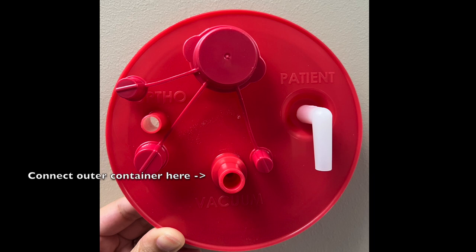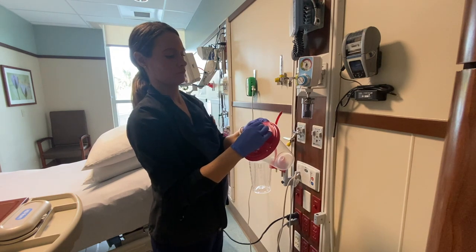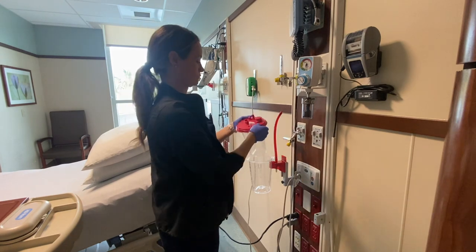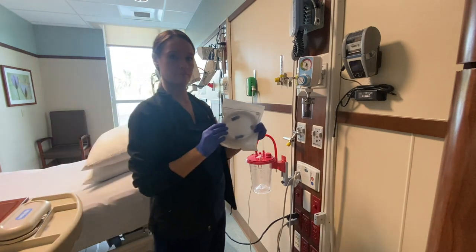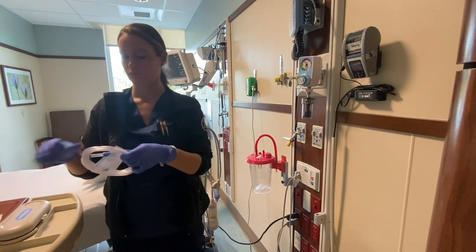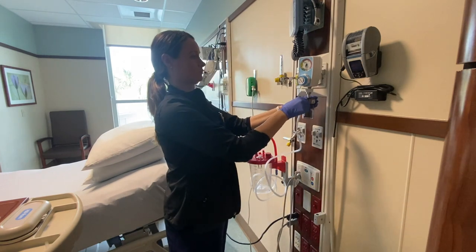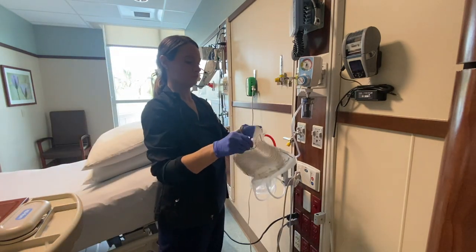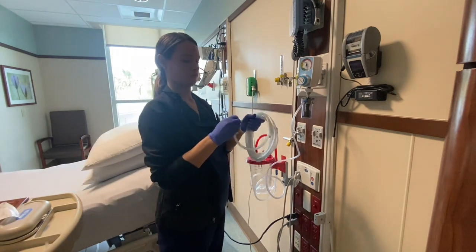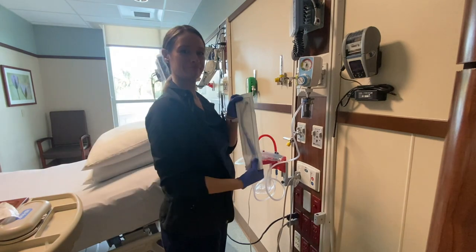Then we're going to connect the outer container to the inner container at the vacuum port. Next, we're going to take our short tubing and connect it to the bottom of the outer canister and to the vacuum wall unit. I always like to check at this point to make sure that the suction is working. If the suction is not working, I usually forgot to cover the ortho port. Then we're going to take the long suction tubing and connect it to the patient port.